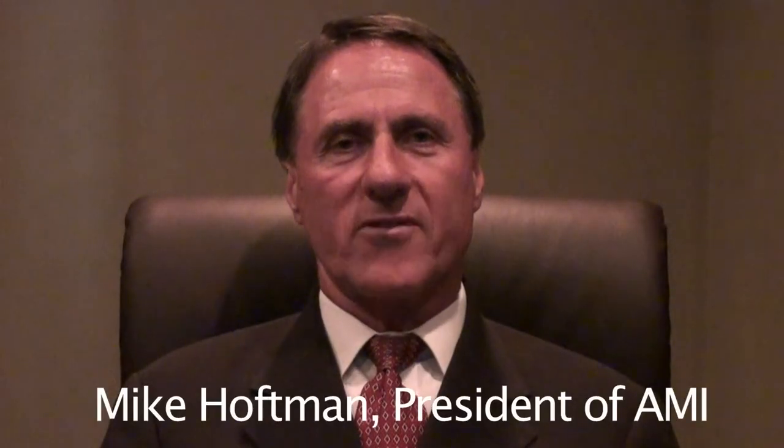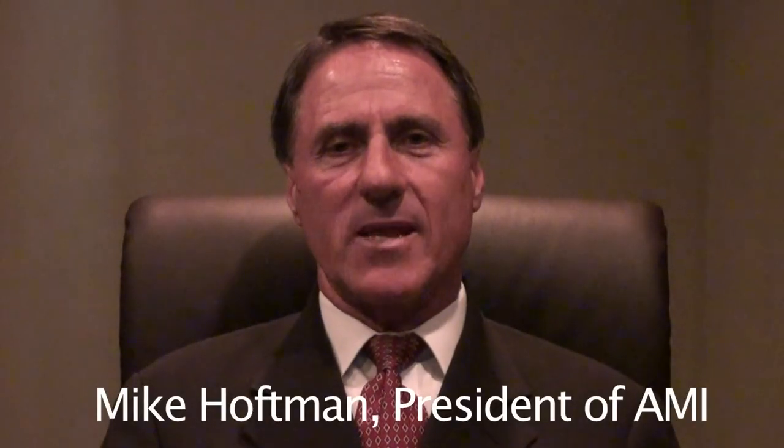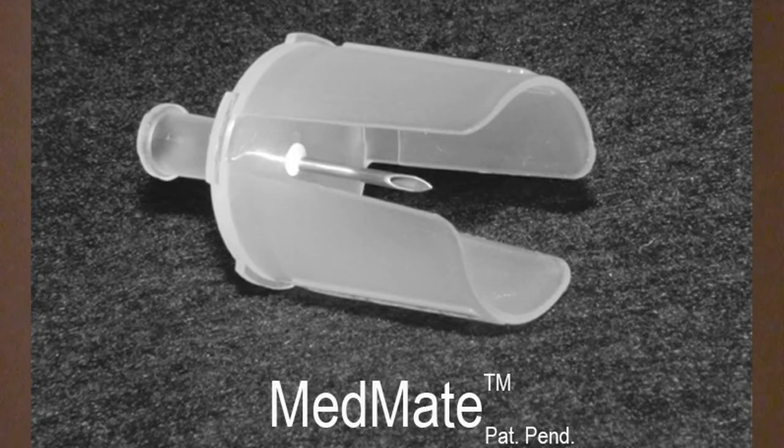Hello, I'm Mike Hoffman, President of Advanced Medical Innovation, and I'm excited to introduce MedMate, a patented revolutionary new product engineered with your safety in mind.